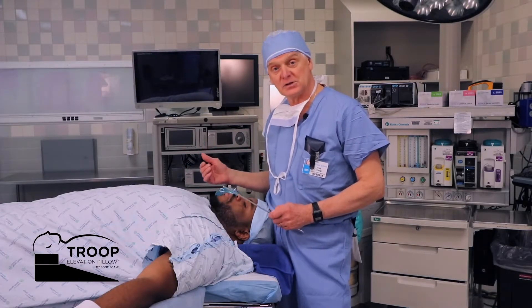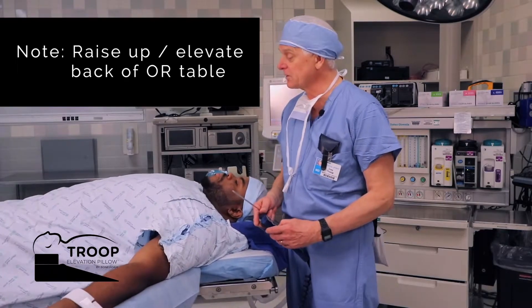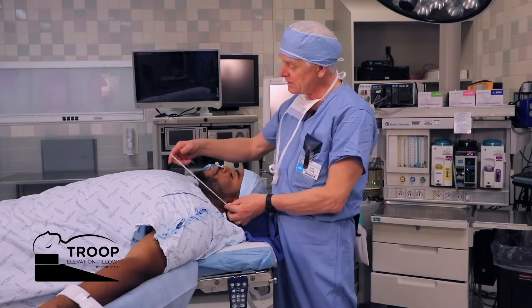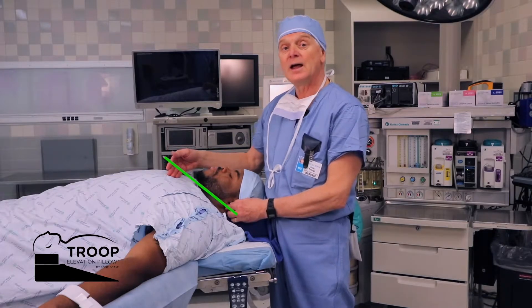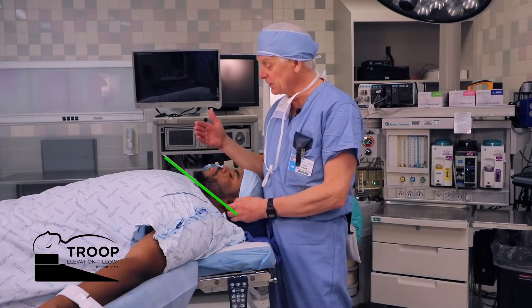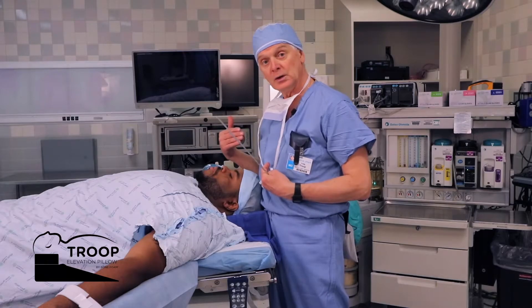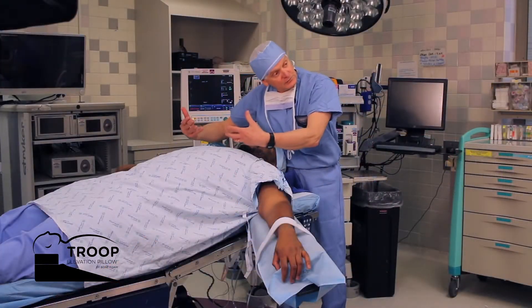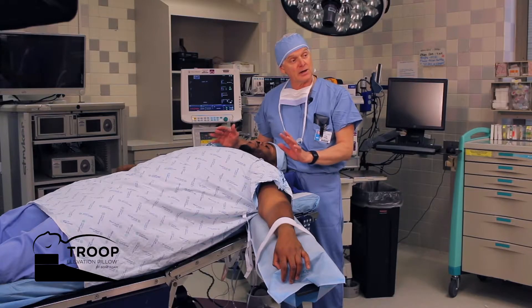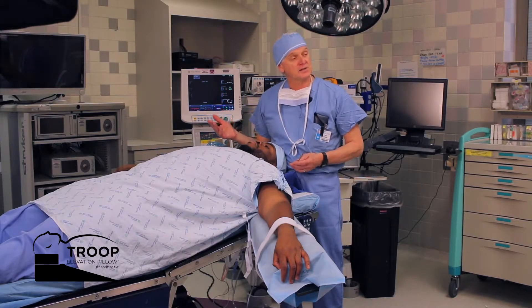What we want to do is start from a ramped position. Over the years I've heard people say, just adjust the backup control — that's all you need to do. So that's what I've done right now. Now we're in more of a head-up position, but notice the imaginary line from the ear to the suprasternal notch has not changed. We haven't altered the airway axes at all. What we've done is move the larger patient's airway, head, and neck up and away from you, the anesthesia provider. Now you're having to lean forward, putting stress on your own back and making things worse — without actually improving the first pass success rate for intubation.